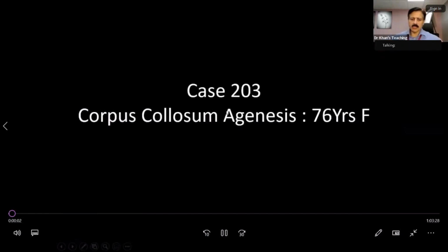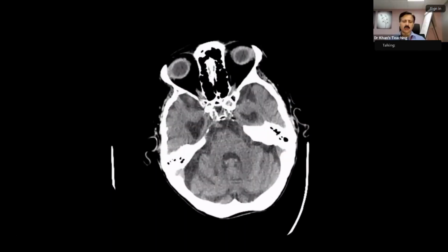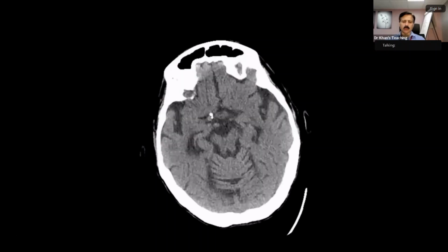Candidate 6, can you see a case here? Case 203 on your screen. Okay, this is just a teaching case, so I don't want to bother you.